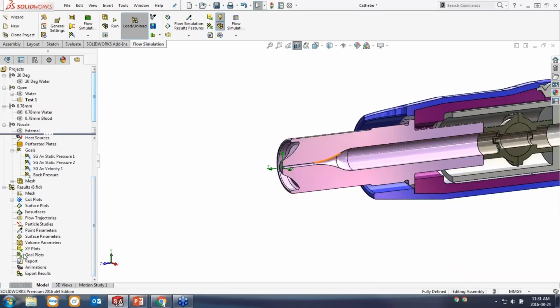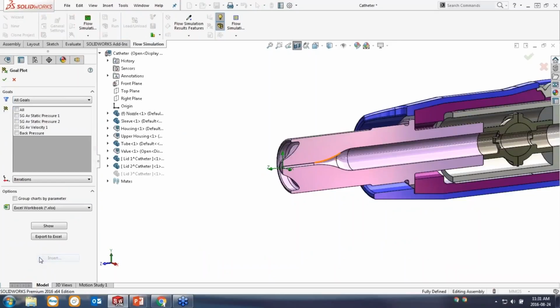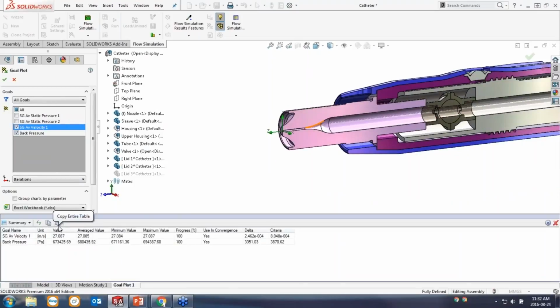The other thing that I like to do right away is take a look at my goals. I told the software those are the important values. Well, let's find out what those values actually are. I'm going to take a look at my back pressure. I'm going to take a look at my exit velocity. And I can see that, yep, it's exiting too quickly. That's over 20 meters per second, the average value across that exit port.